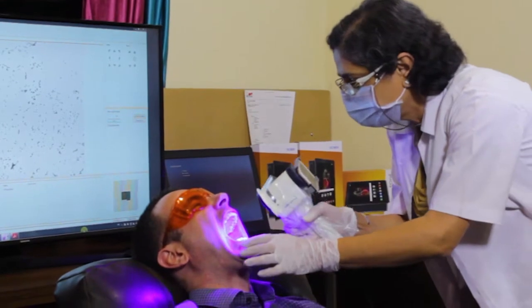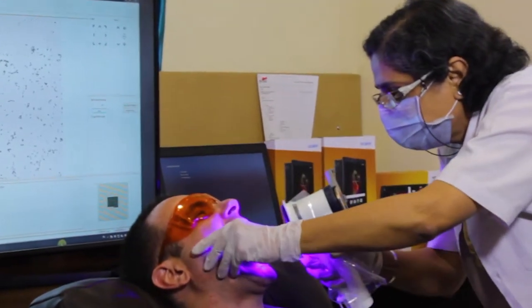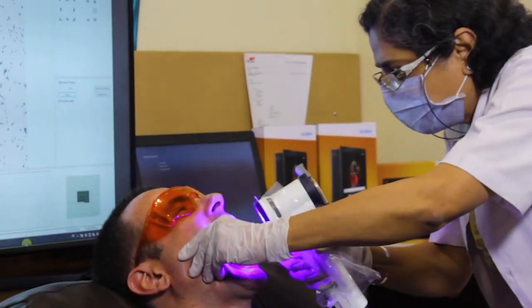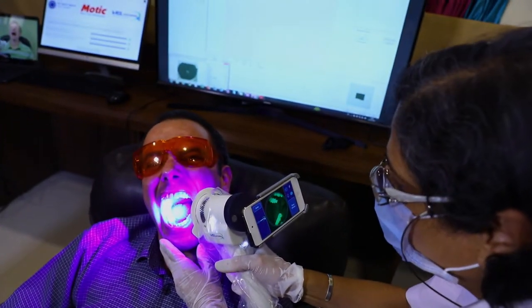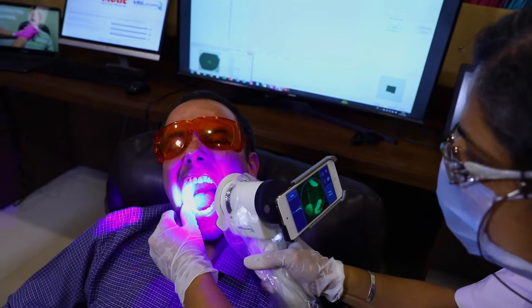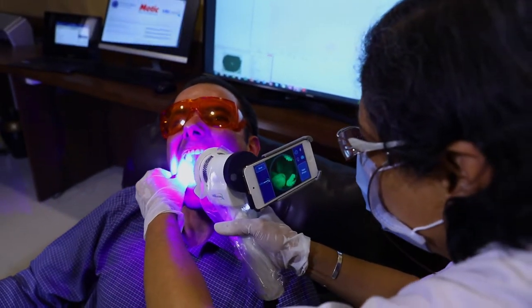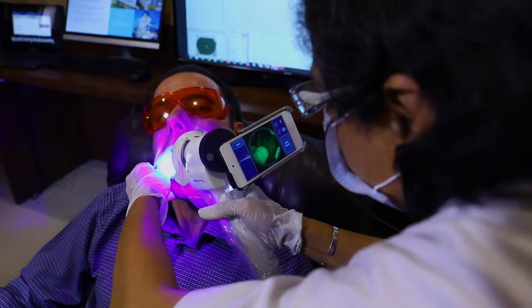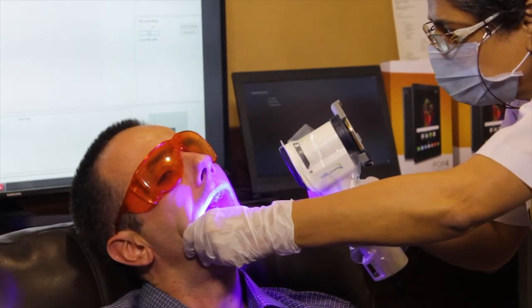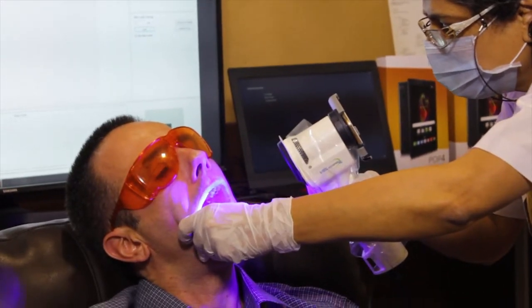The patient is asked to open, and the oral cavity is shown inside. You can see the oral cavity mucosa here and we watch for the blackish spots. On this side of the cheek — just relax your cheek — there is one area which is looking a little bit blackish.